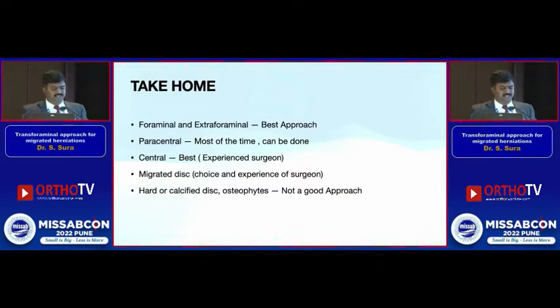So take-home message. The transforaminal technique is a very important technique for migrated fragments, especially when the patient has previous surgeries. The patient underwent previous laminectomies. It's the best approach you can use without violating the dura.